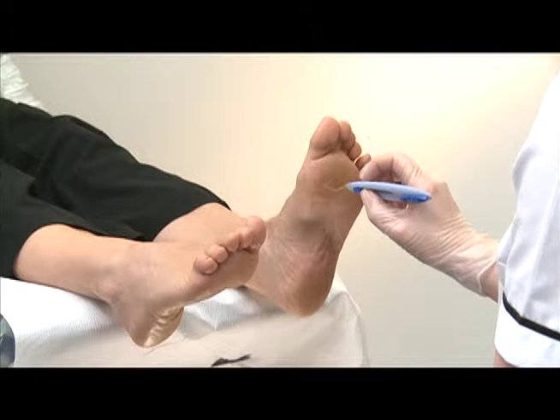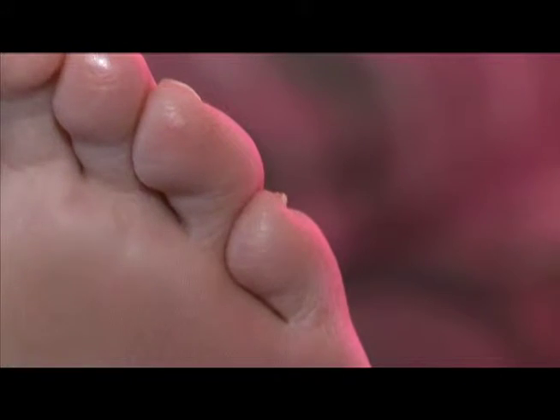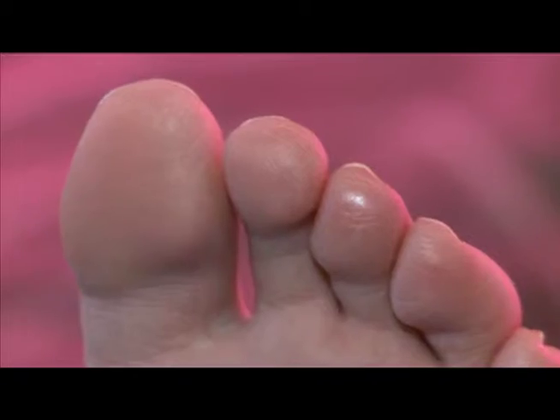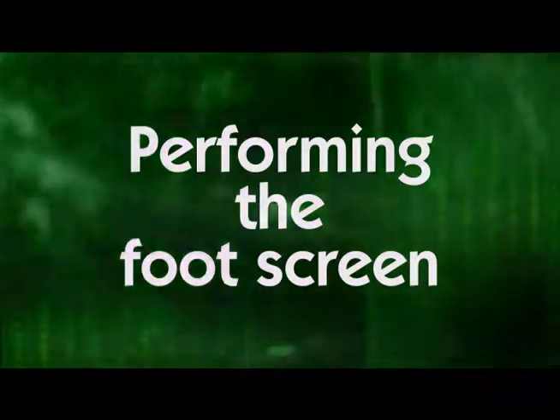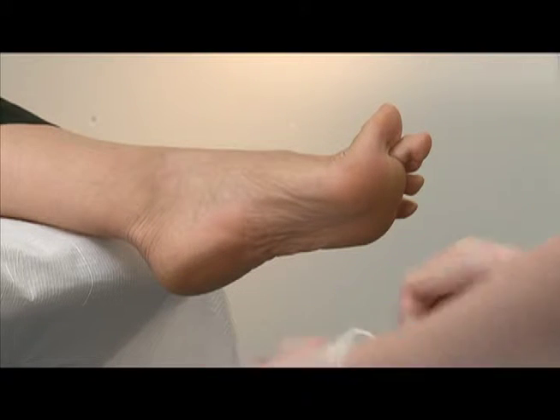The sites and timings should be randomised to prevent the patient guessing. Ask the patient if they're experiencing any pain, paresthesia, usually described as tingling or burning in their feet, and record as appropriate. We are now going to carry out a simple diabetic foot screening on our patient in a clinical situation.